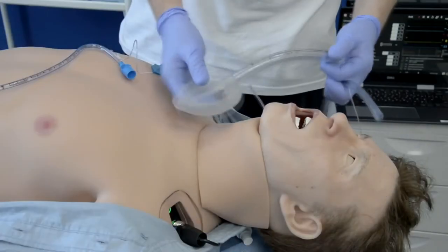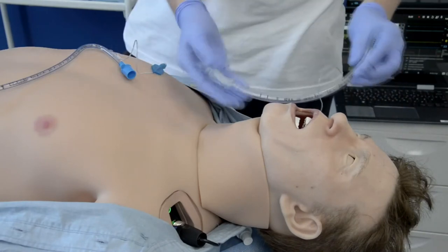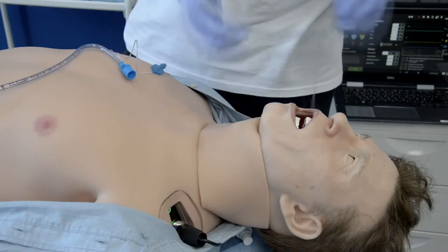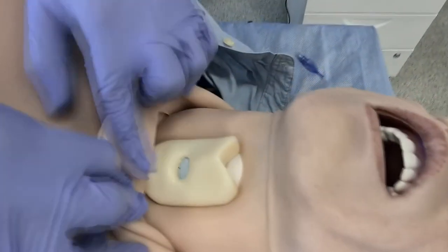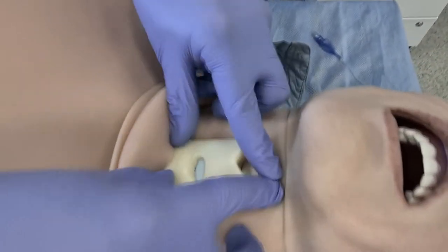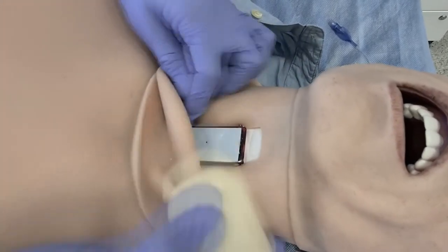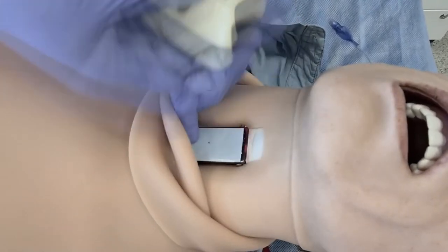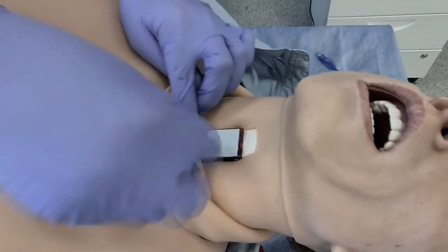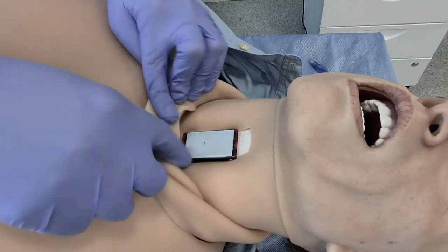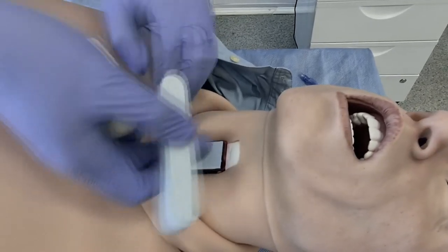Leo supports most types of supraglottic devices including LMAs, ET tubes size 6-8, NT tubes, and Combi tubes. We try to minimize use of consumables with smart solutions to make it easy and effective for your daily training workflow. For cricothyrotomy, we use soft double-sided sticky tape — an inexpensive and effective solution.